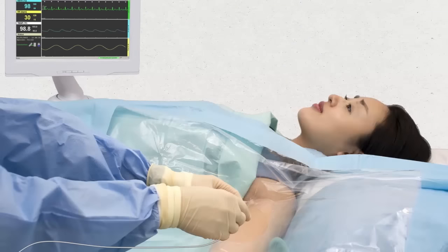During the insertion, you may be attached to a cardiac monitor to enable the nurse or doctor to guide the PIC line into the correct position.